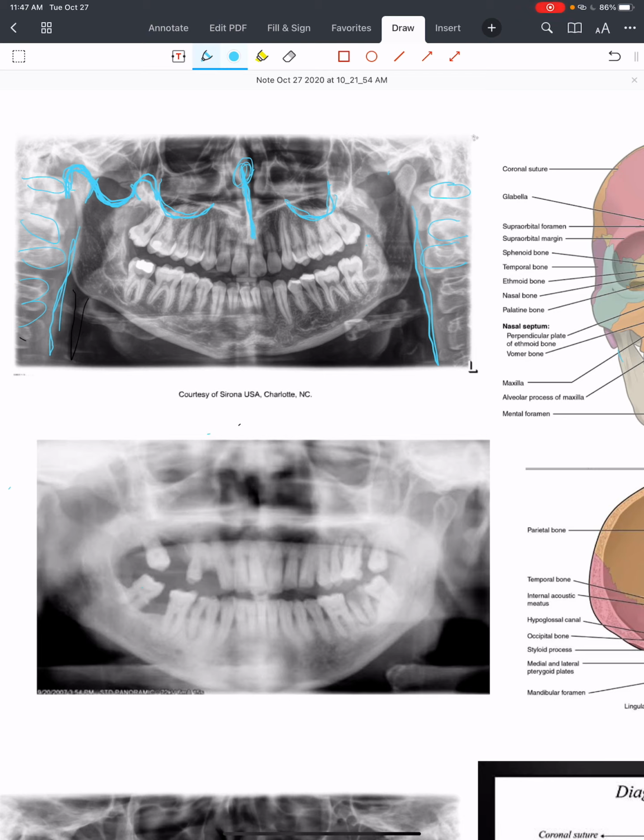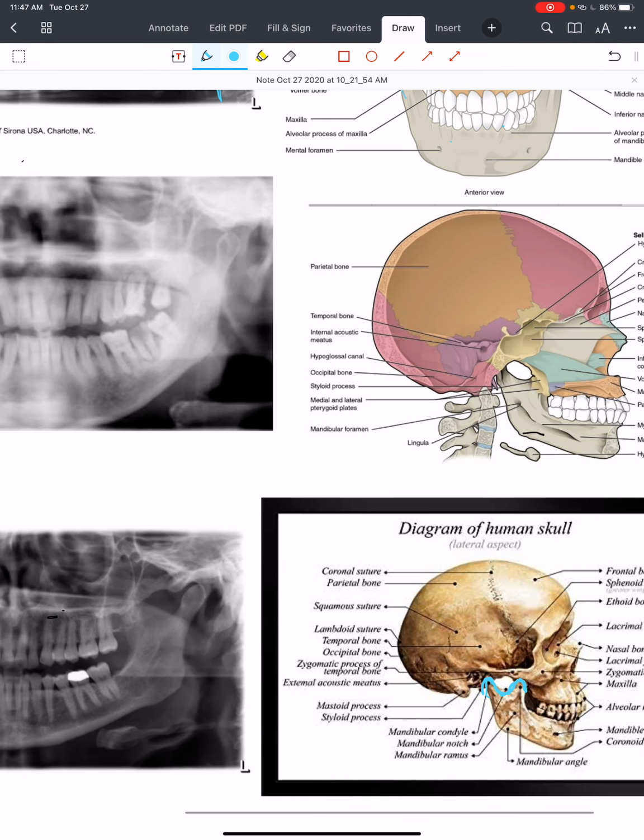And while I was talking about the maxillary sinuses, we see a structure right above that kind of goes through the condyle and the sigmoid notch and the coronoid process, and this is the zygomatic arch, which is really important, and many more structures come off of that piece. So if we go down here, we can put all our pieces together of the mandible.